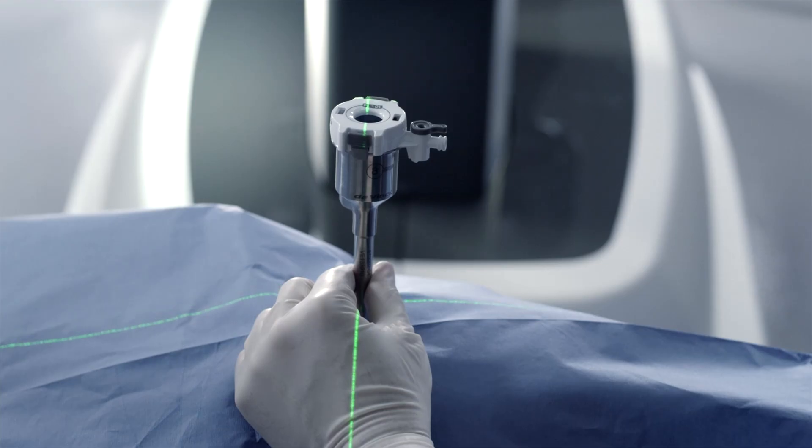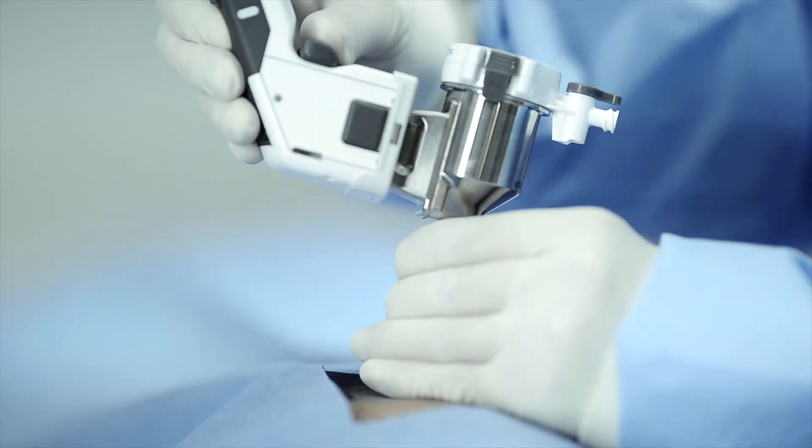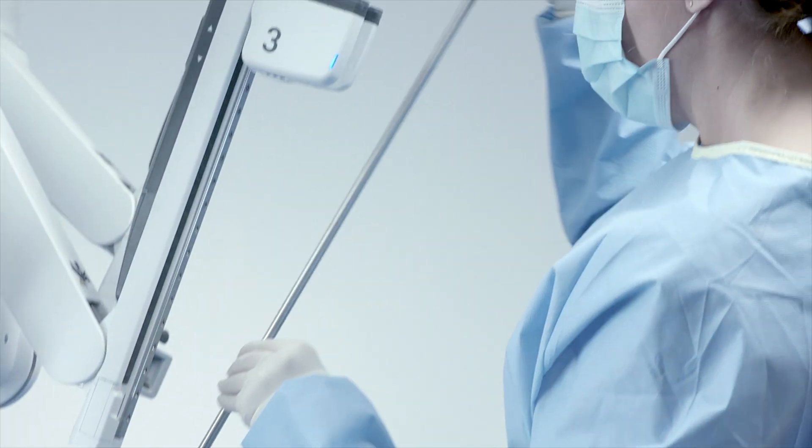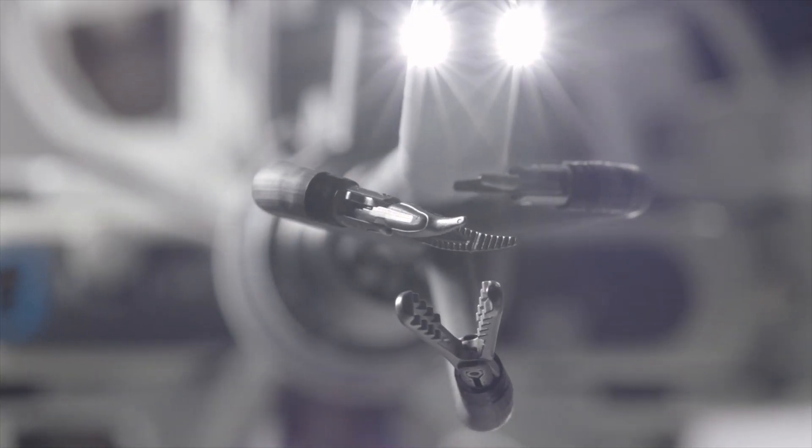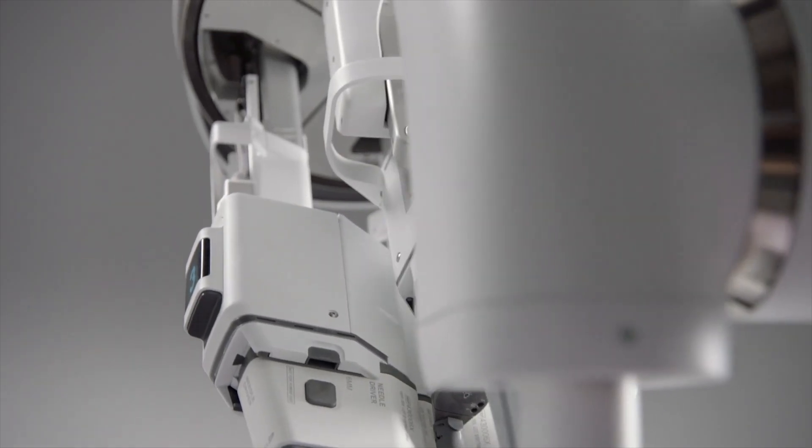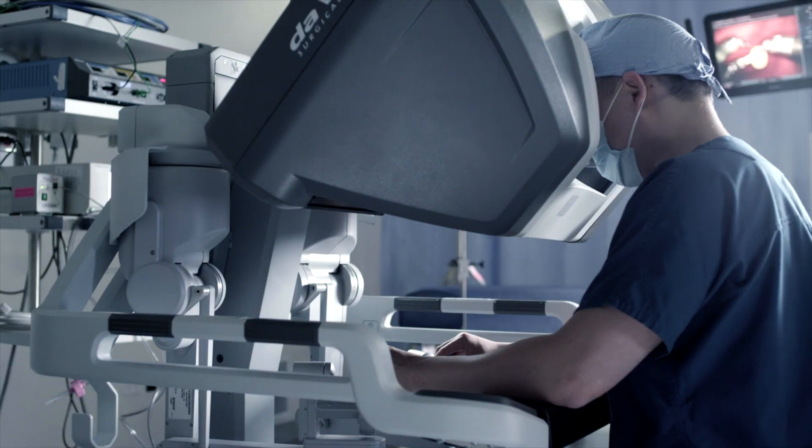We can do more precise surgery. We can do surgery in tighter places that we couldn't do as well before. The complications for a number of these different surgeries have shown to be decreased when done robotically.